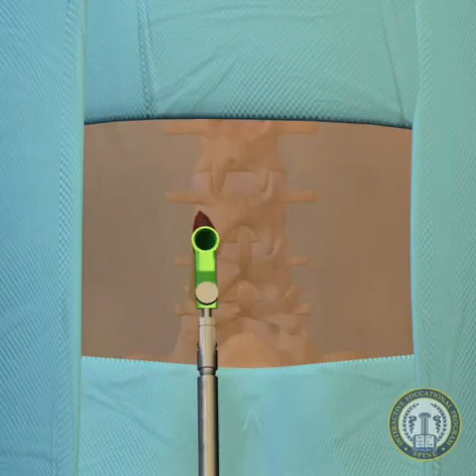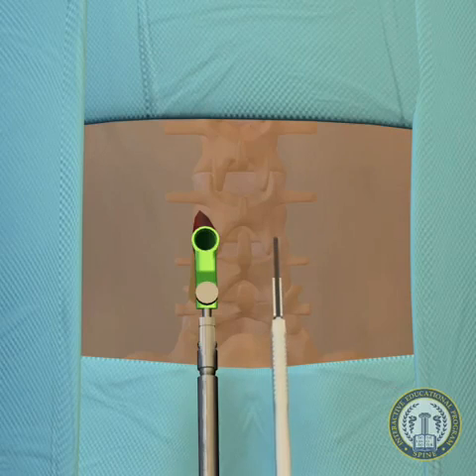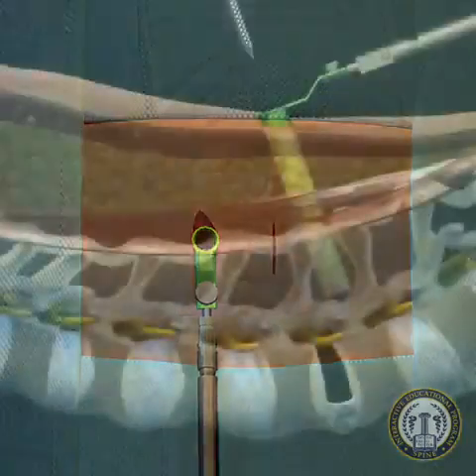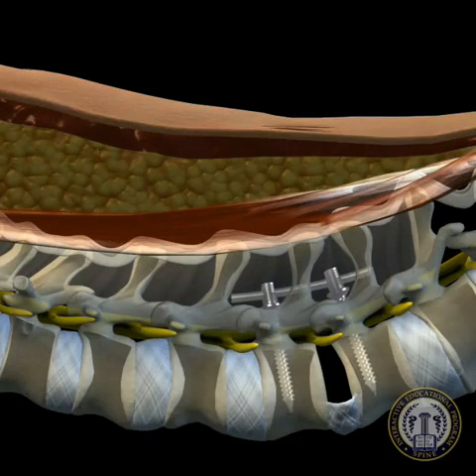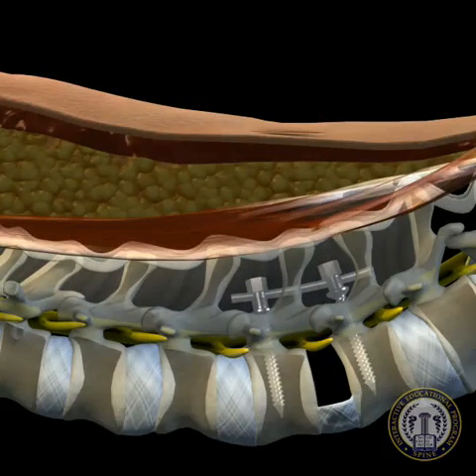Following the discectomy, the disc space may now be distracted by creating a mirror 2.5 cm skin incision on the contralateral side, centered over the disc space. Percutaneous pedicle screws are then placed, and a rod is subfascially levered into place. The contralateral screws are tightened to a distracted position in order to create optimal space for the interbody device.